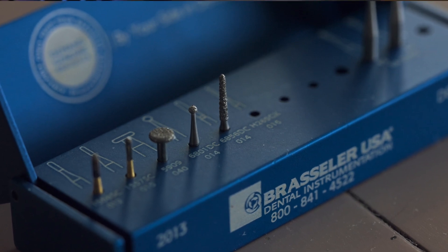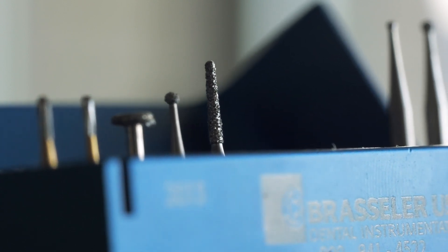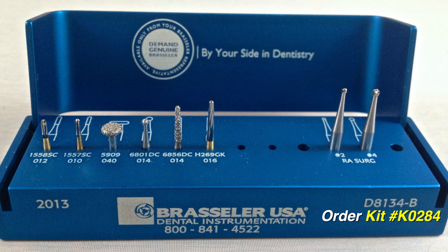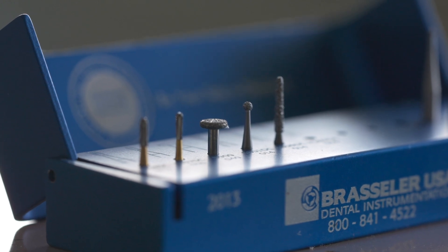In most cases, one or two burrs is all that is needed for accessing a tooth, but in some molars you may need more than two. Having eight burrs will allow enough overlap to help you access both anterior and posterior teeth restored with a variety of restorative materials. In this video, I wanted to share with you each burr in the access kit, why it was chosen, and how it should be used clinically.